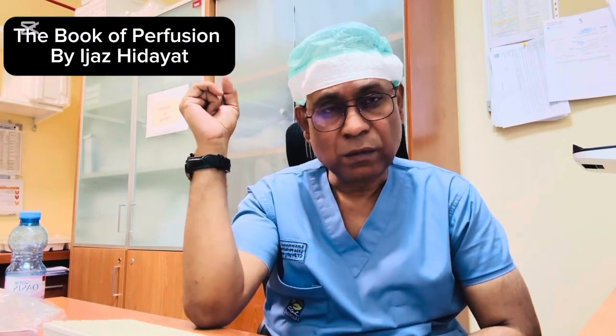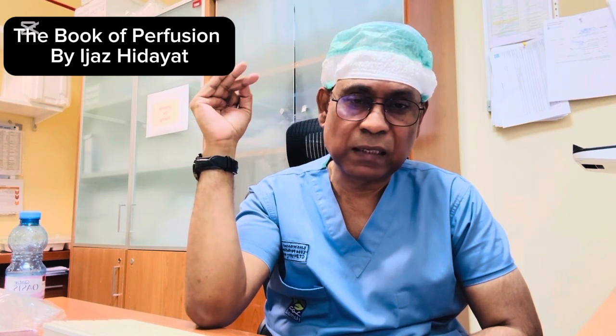So guys, the ECPR is the procedure where every multidisciplinary team member has their own role. As a perfusionist, we are responsible for priming the ECMO circuit, for the insertion kit, and for providing suitable cannulas, arterial and venous. Arterial means return, and venous means access cannula, because in activation mostly we have VA ECMO activations, but sometimes we do VV ECMO also, or sometimes we change the configuration of the cannulas like VAV or VVA.